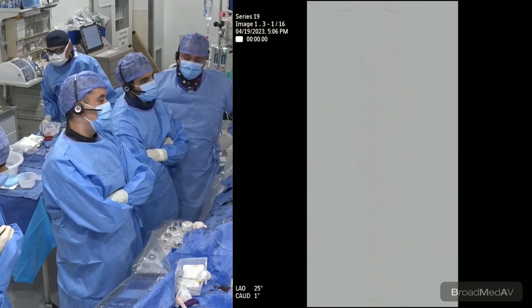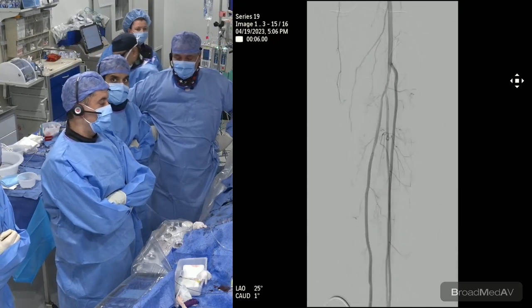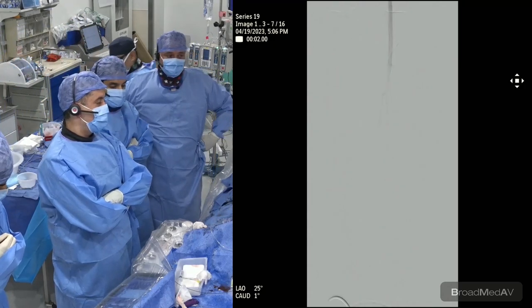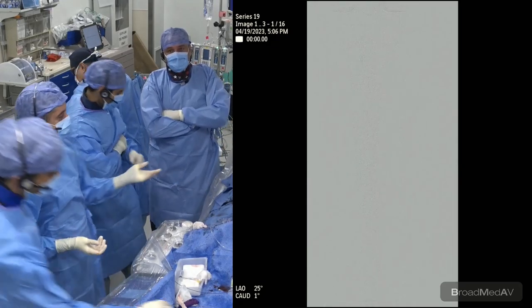And we know that if you have a good vein, this patient should do better with BEST-CLI, meaning bypass surgery with the vein versus angioplasty or whatever best therapy was available then. So can you comment, in the context of BEST-CLI, why we chose to do endo in this particular lesion?